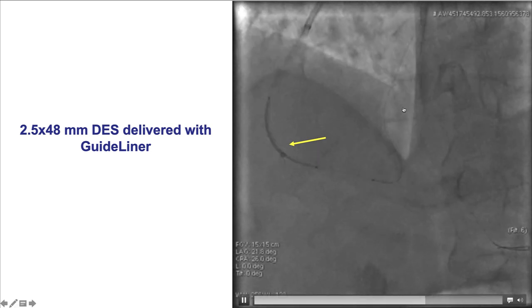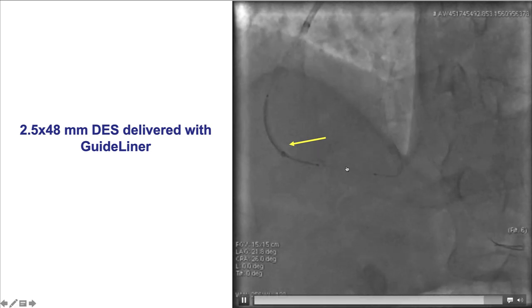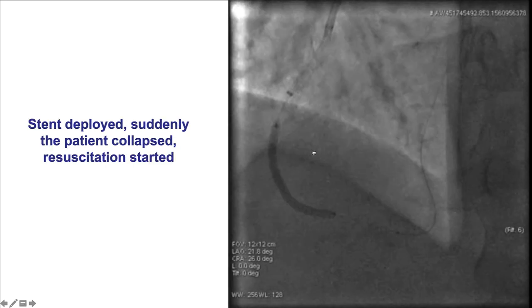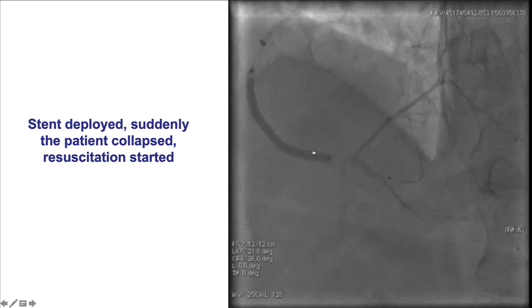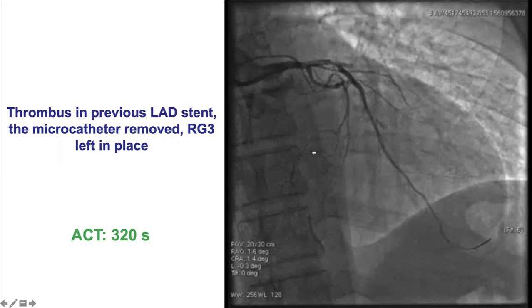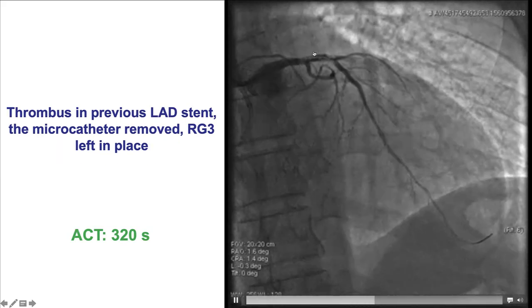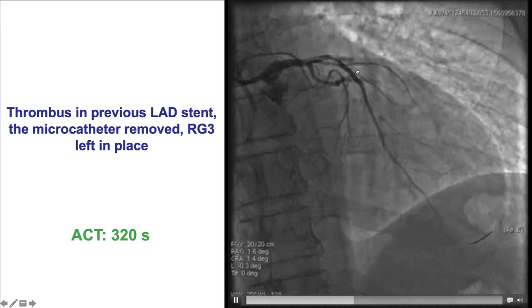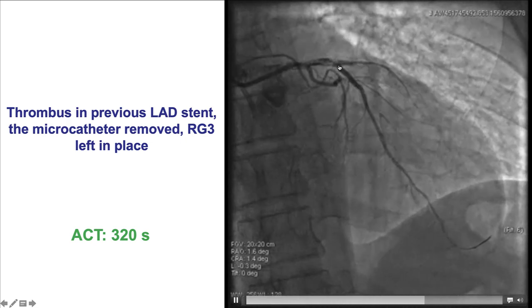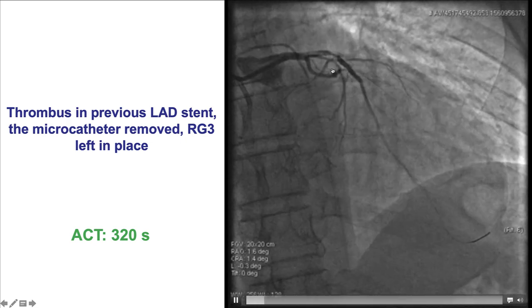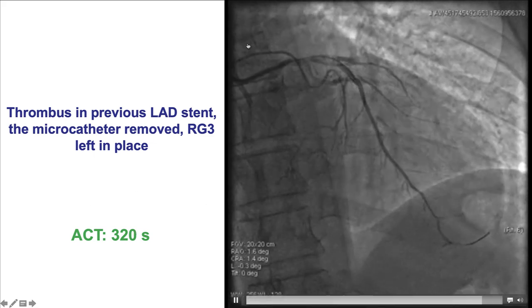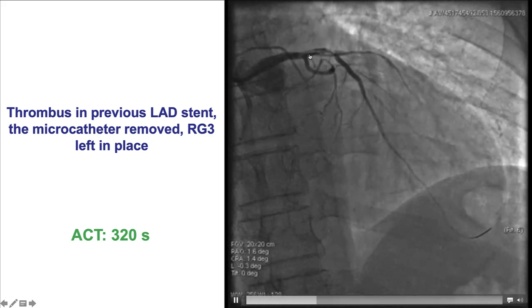Contralateral injections are very important to visualize the bifurcation and allow for accurate placement of the stent. However, the patient at this point had a hemodynamic collapse and was started on CPR. An injection of the left system revealed the cause, which was thrombosis within the previously placed LAD stent. The previously placed stent was relatively small at 2.5 x 2.75, and even though the ACT was 320 seconds, thrombosis still formed within the LAD.